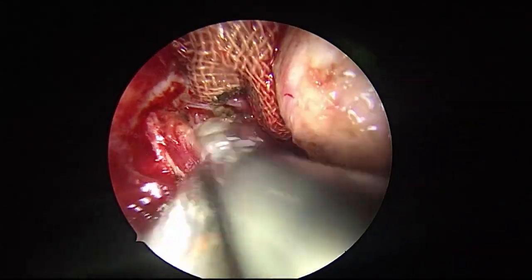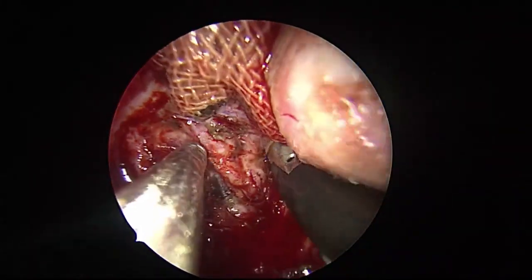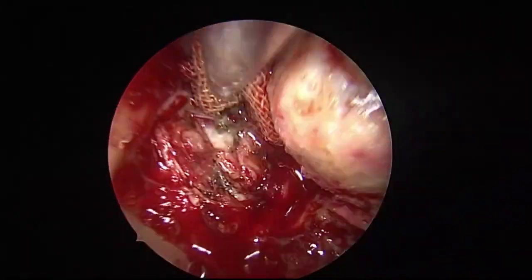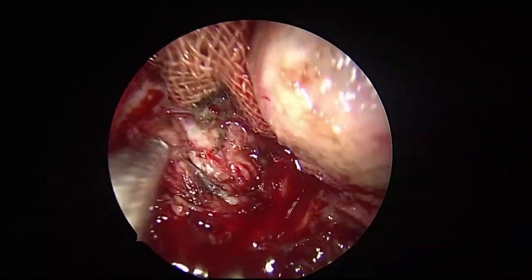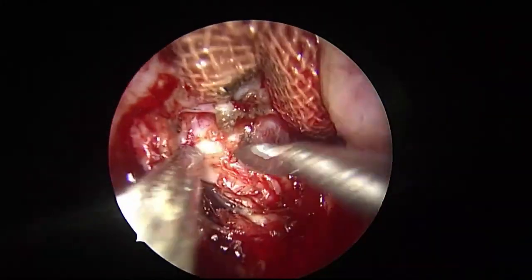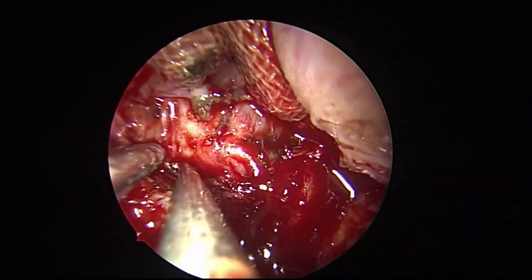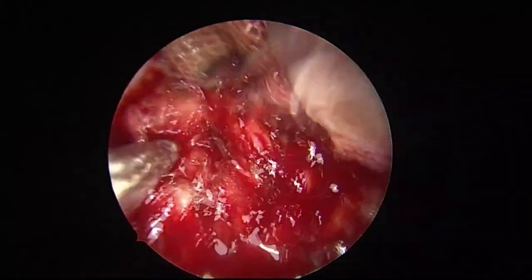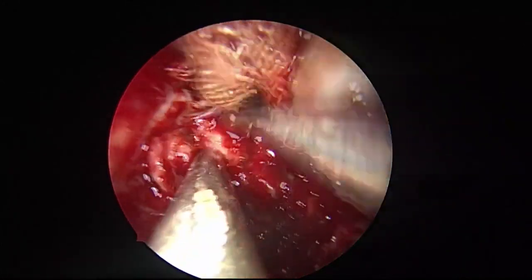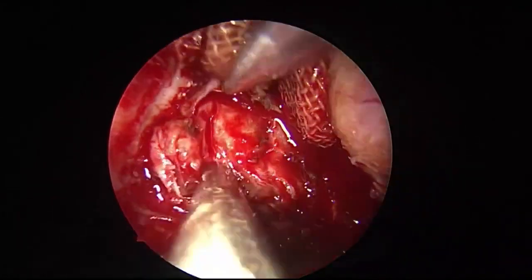See, this is the tumor surface. What I have exposed is the tumor surface. Could you see? Yes, sir. This is all tumor surface I am exposing. Yes, sir. We can see.